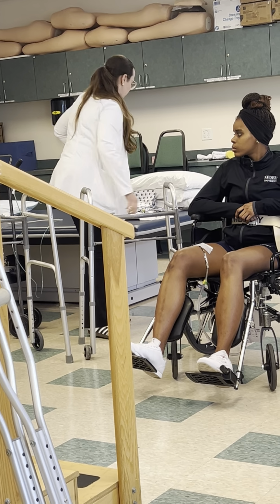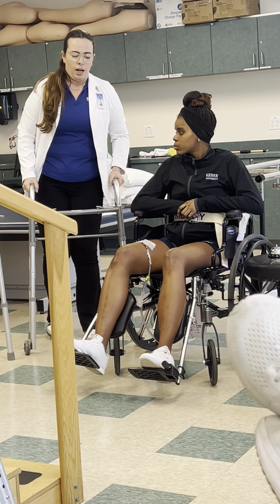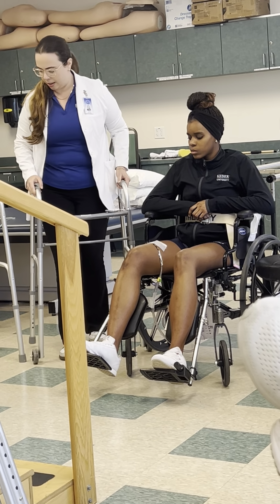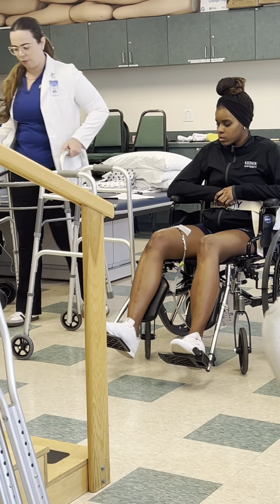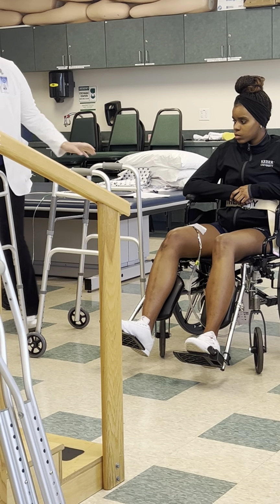So I'll be communicating the level of assistance. I'll have here the walker for the patient. I'll have the walker for myself.